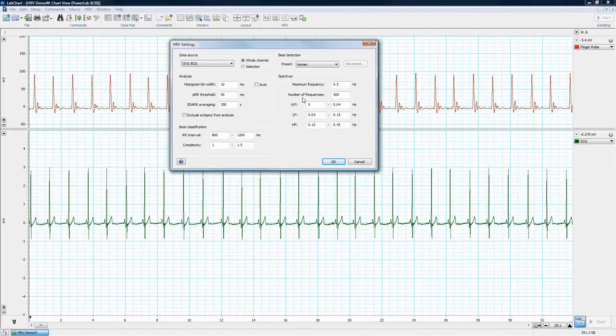So very low is a little more disputable as far as what the variation within it means, but it's often considered to represent sympathetic tone, as well as slower humoral, just bodily changes and thermoregulatory effects on the heart rate variability. There are also some findings that in shorter recordings, the very low frequency band is a fair representation of emotions, whether the subject is stressed or not.